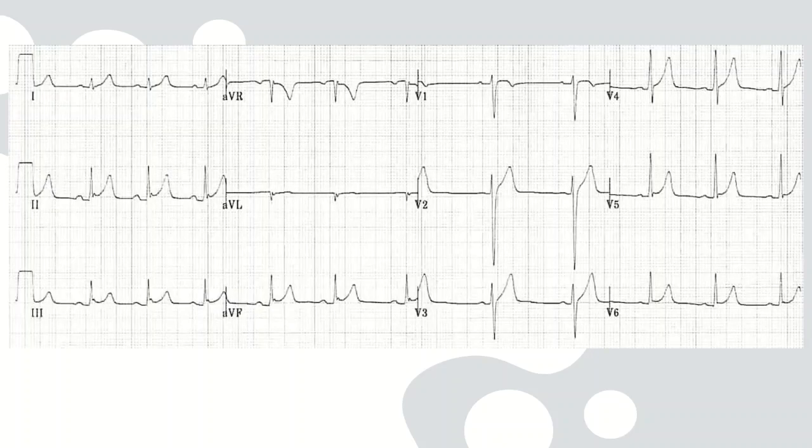Now look at this ECG. So if I can take a laser pointer, now here if you see the precordial leads, you would see that the ST elevation is sort of concave. And you see the T waves are upright, they are concordant T waves. And you see here on the ST elevations which are widespread you see some notching, notching of the ST points.